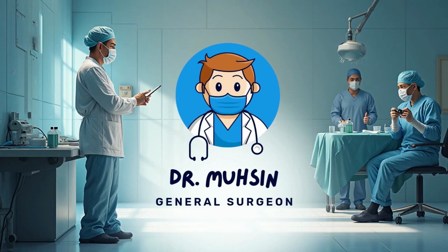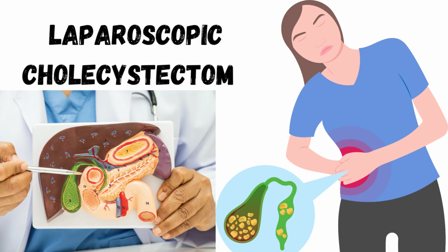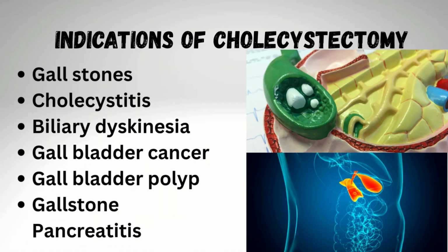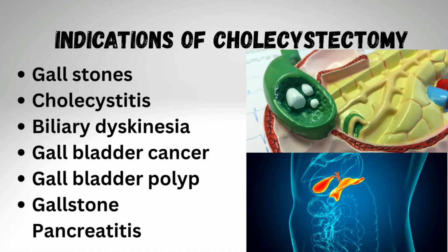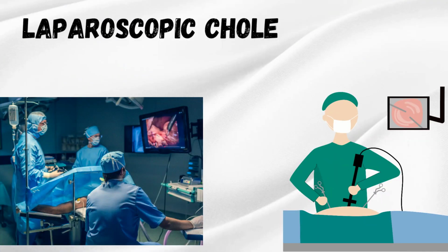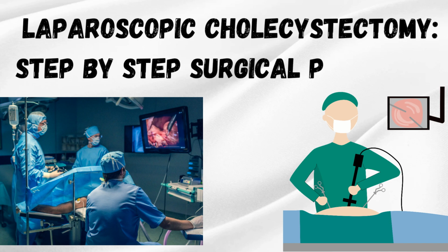Mohsen. Today we are discussing the laparoscopic cholecystectomy procedure, which is a minimally invasive technique for the removal of the gallbladder from your body. Before discussing it, we should know the indications of cholecystectomy, which include gallstones, cholecystitis, biliary dyskinesia, gallbladder cancer, gallbladder polyps, or gallstone pancreatitis. The laparoscopic cholecystectomy procedure steps are discussed in this video.